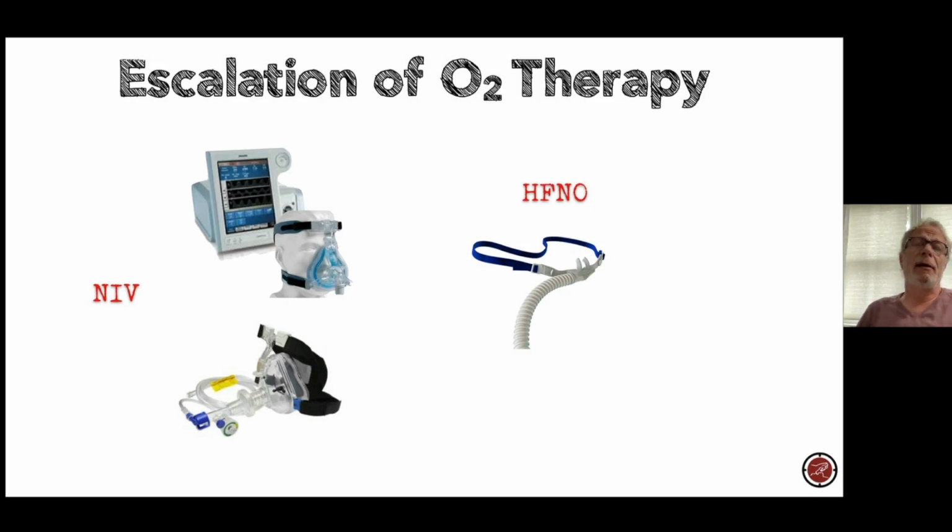The next step, and again, this is for any patient where COVID-19 is suspected, is that you might escalate to using a device that's meant to deliver higher flows and pressurized flows. So, escalation of oxygen therapy. And really, there are 2 groups, and there's a lot of terminology mix-up. The way we describe it, there's non-invasive ventilation, which captures CPAP and BiPAP, and then there's the commercial humidified high flow nasal oxygen, whether it's Vapotherm or OptiFlow or whatever you have.